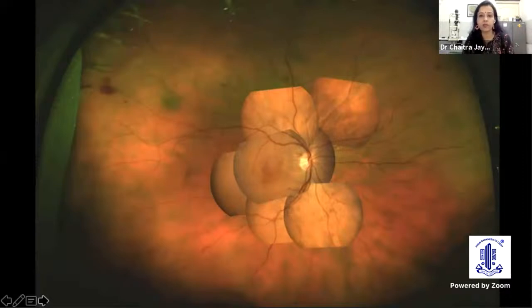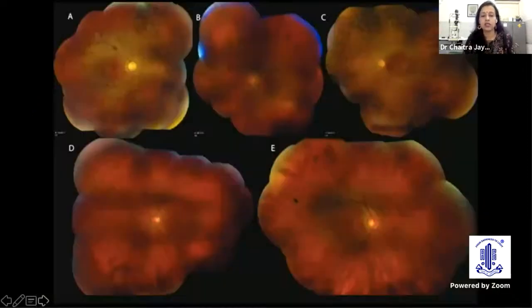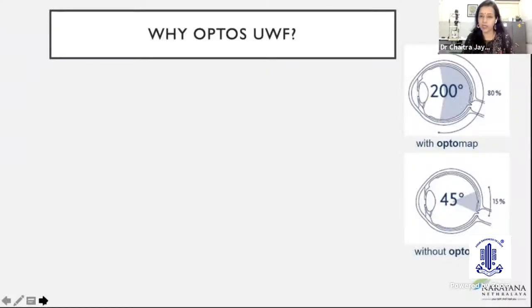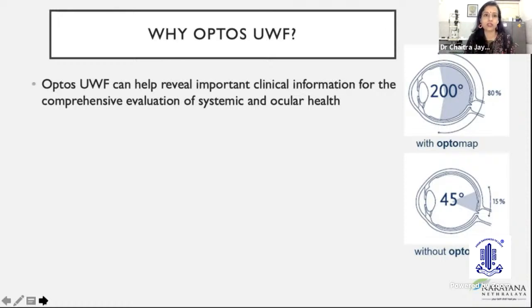So this is what I meant by montaging. You have to actually manually do it. Some instruments do it on their own also, auto-montaging, but it's just not the same. These are some of the other images of montaging. You can see that the uniformity of the image is lost. Sometimes the exposure may be different in each one of the captures, so we may not be able to see much. Therefore, we do prefer the Optos, with 200 degrees in comparison to just about 15 degrees or 45 degrees of view, where 15% of the retina is seen.